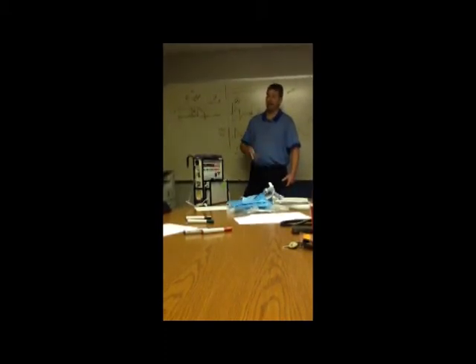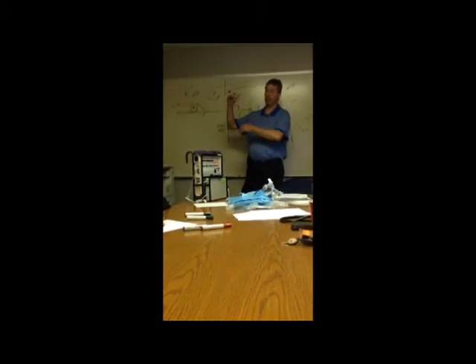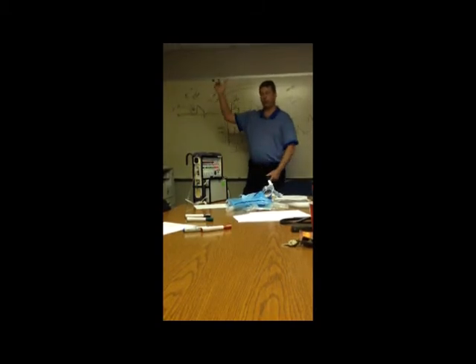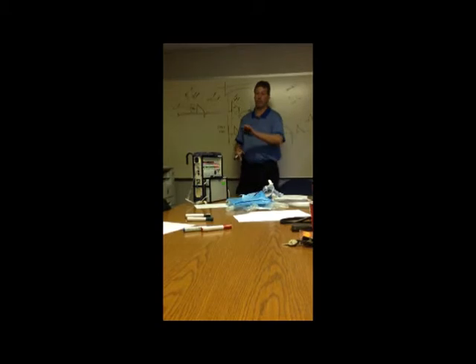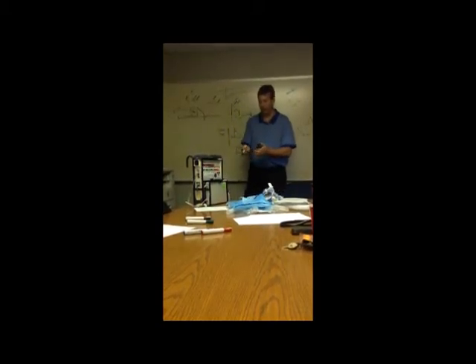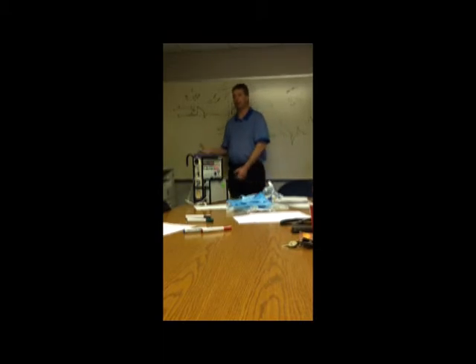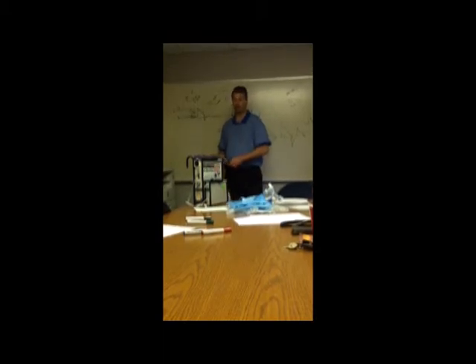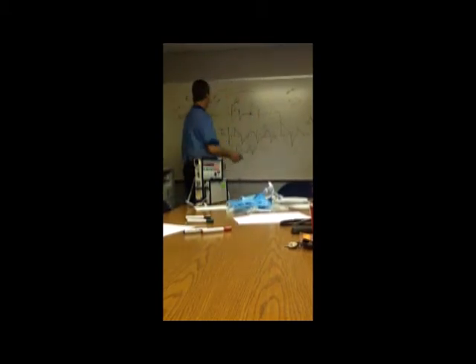And I wouldn't go over about 10, maybe 12 on EPAP if I'm trying to improve their oxygen. Anything past that, you're going to be putting too much air in their belly, because to ventilate them, the other numbers have to move, the whole peak pressure moves, and you're filling their belly as well. The higher EPAPs also open up their esophagus. The esophagus stays closed, but if you get to a certain amount of pressure, it holds it open. So the more EPAP helps get to that number. So if I'm not oxygenating at those settings, I'm going to intubate them at that point.